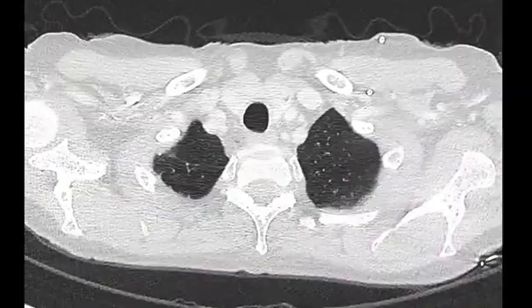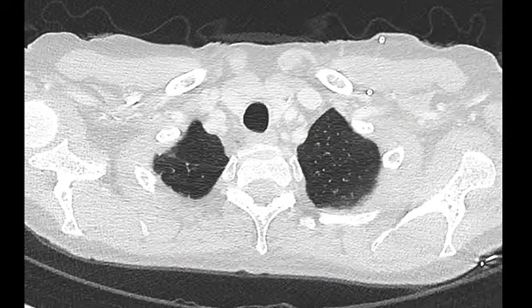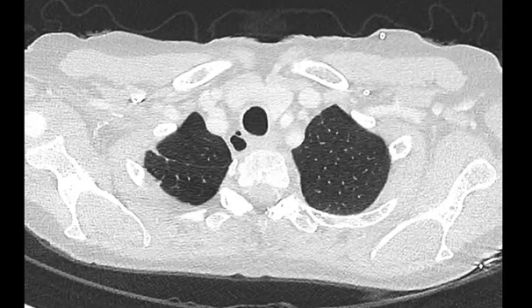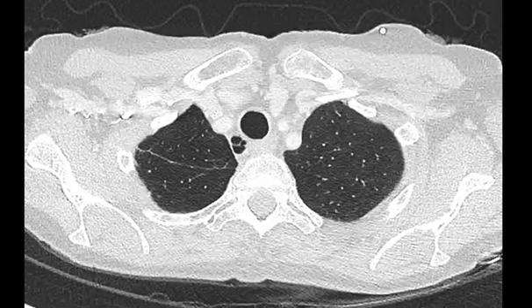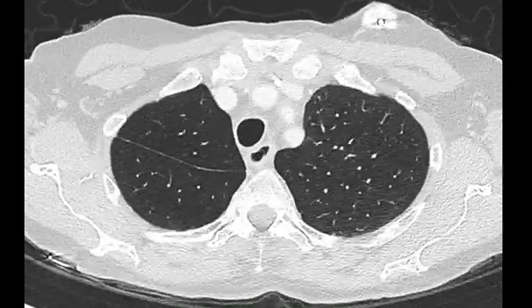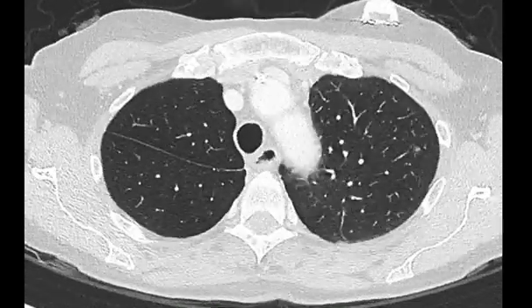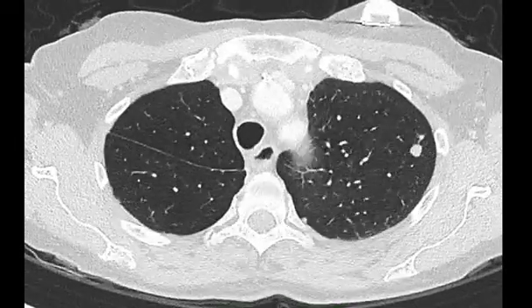Hi, it's Barton Jennings here. Thank you for asking me to have a look at this CT scan. This lady has a history of metastatic colorectal cancer and there are metastases in the lung. The question is, can bronchoscopic biopsy access these lesions for tissue for clinical trials?